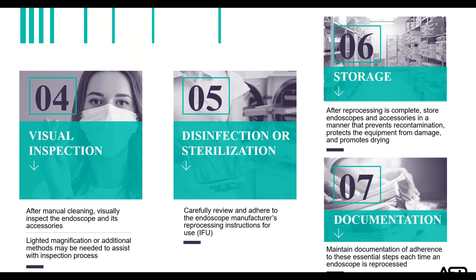And sometimes I get pushback about sterilization being so much more difficult, but when you look at it, many of the processes or steps are consistent for both up until a certain point. Always reference the manufacturer's instructions for use for determining which modality can be used when reprocessing the scope.